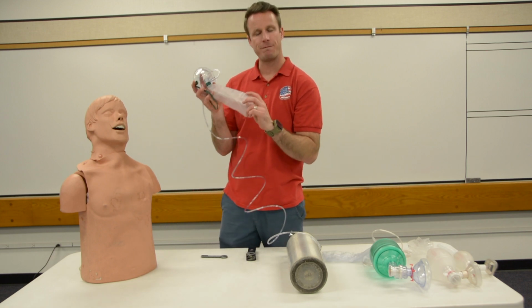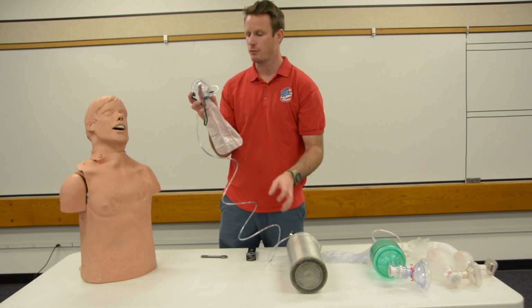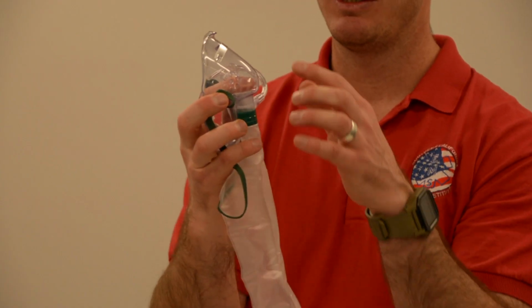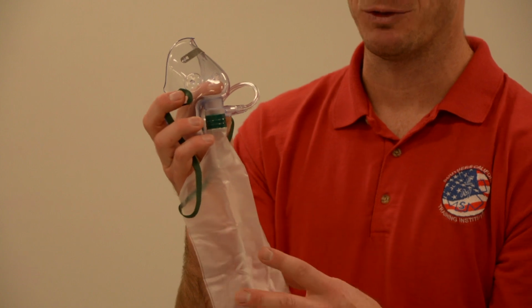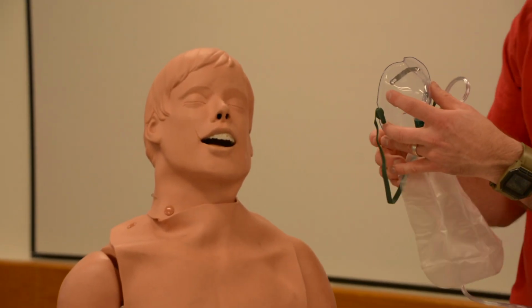And I need to go ahead and fill up my reservoir bag before I put this on the patient's face. So in order to do that, you take your finger and you put it right here over the little valve, almost right where the nose goes, and you just fill up this reservoir bag. After this is all nice and full, we're going to put it on our patient's face.